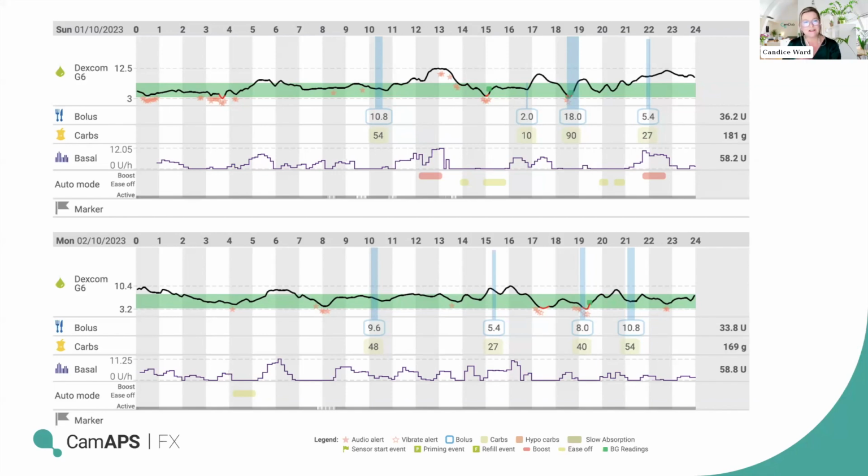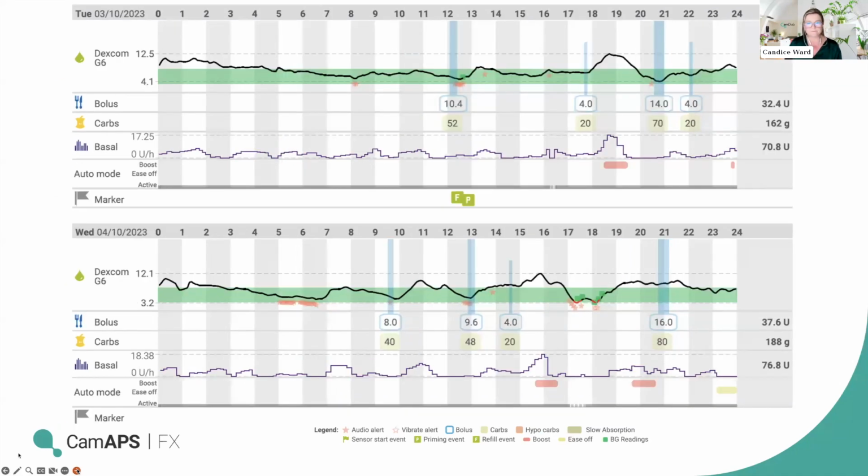I think because she came to the system so late in her pregnancy, which is quite tricky, learning about the system and how to trust it is often really hard, and we need to support people through that. So you can see here she's doing set changes and really struggling with getting the right bolus at the right time. But if we can reduce that, and also try to keep away from these very large carbohydrate meals.